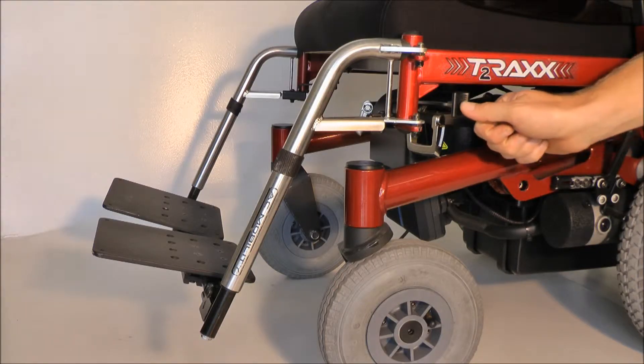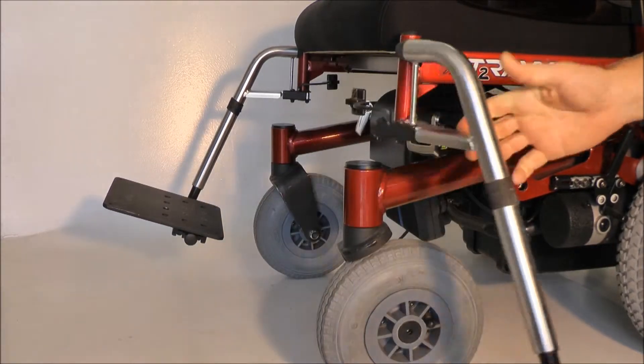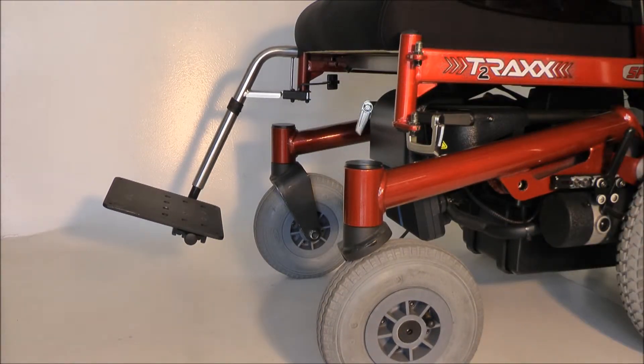To remove the leg hanger, all you have to do is push the little button underneath the seat rail. The leg hanger swings out and can be lifted off the seat rail, like that.